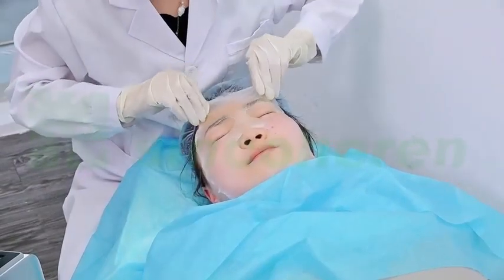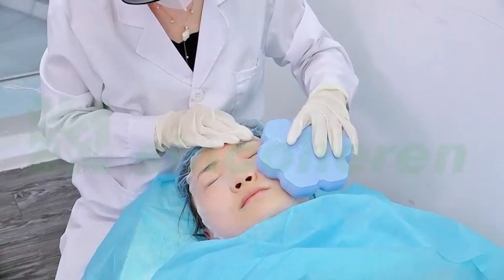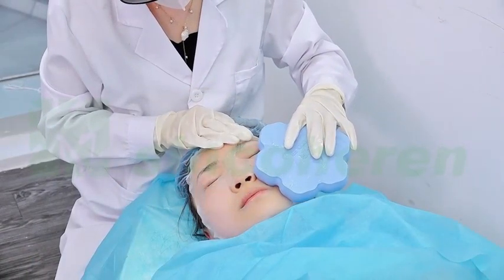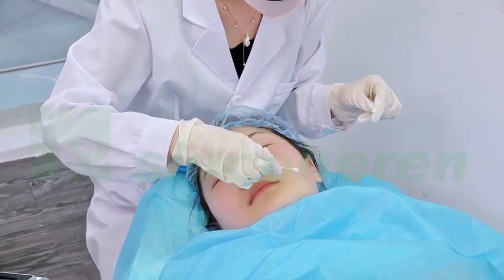After the treatment, use mask to hydrate, cool, and smooth the skin. At last, apply thin growth factor or antibiotic ointment.